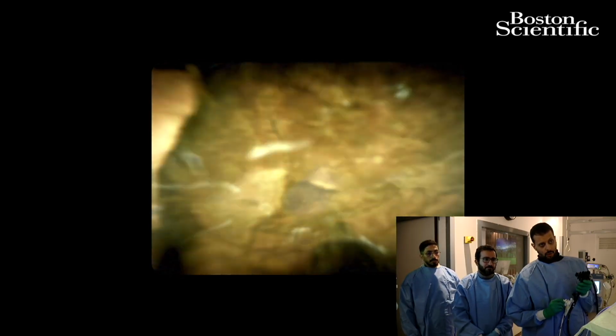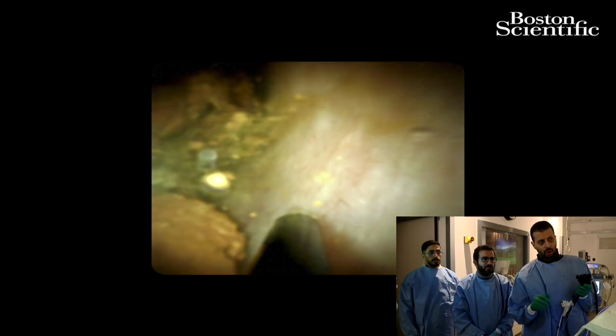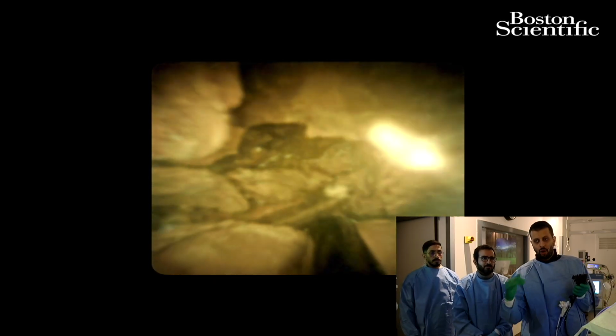Go. And what about for laser? So here we have a pre-setup of the laser catheter. In all honesty, we just hook it to the system, and then we try to get the laser therapy as short as possible in terms of pulses. We have low, medium, and high.